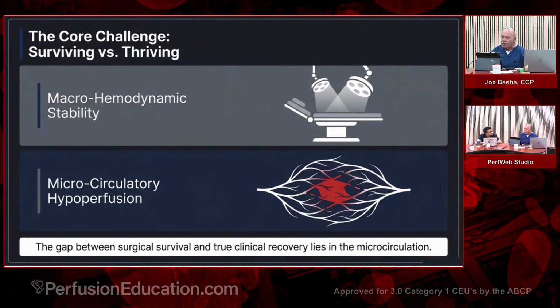We come off bypass, and somewhere along the way of this procedure, before we actually came off bypass, as things were wrapping up, the surgeon, Dr. Patel, decided, yeah, I'm going to stick a femoral arterial line in. Just screw this. He put a femoral arterial line in. What a difference. Now, anesthesia argued the mean's not that different. It's only 10.